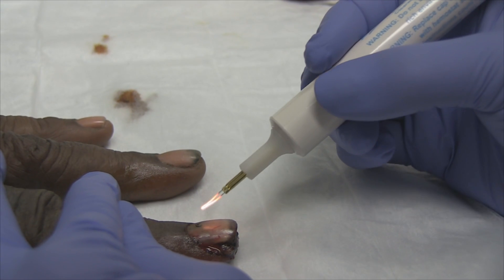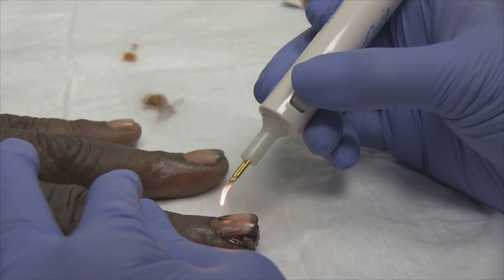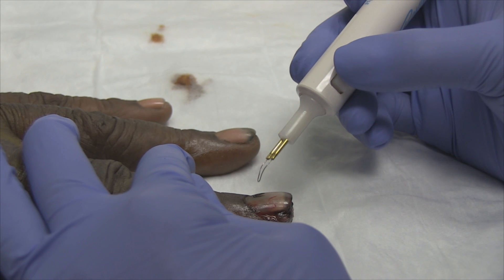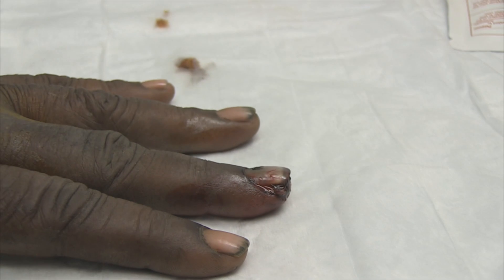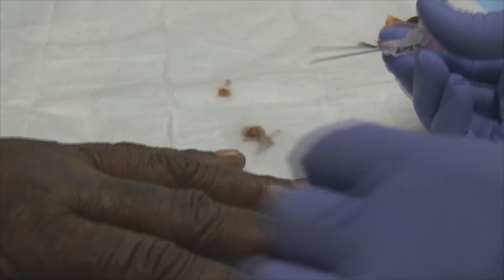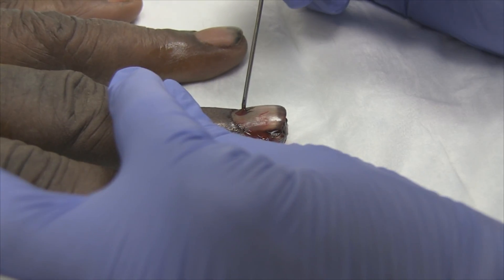A little bit more. Turn it around like that. He doesn't like the smell of this. What I think I would do next is try the 18-gauge needle on that because I don't know if it's just doing a good job of cauterizing, but the blood hasn't come up through there yet. So you're going to just start spinning with that thing. There we go — now you've got the blood coming back out of there.